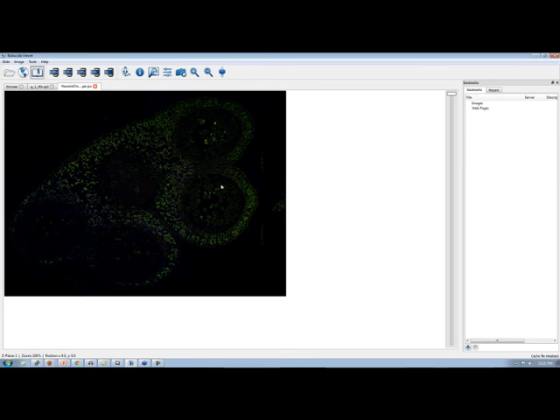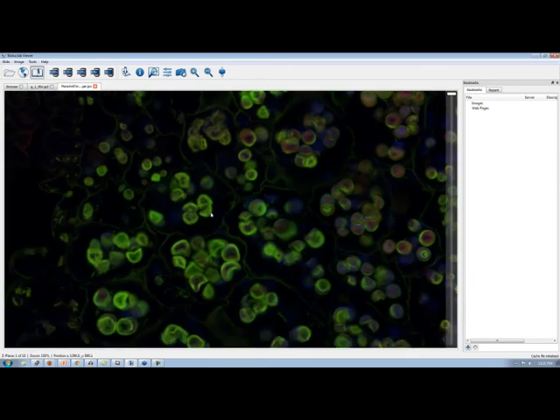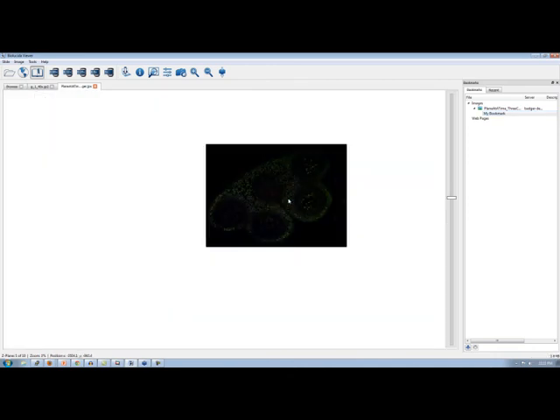What that allows you to do is go to any region that you're interested in, any magnification, any focal plane, and then you can hit this little plus down in the lower corner. That pops up this little bookmark at the top if you see it. You can enter in a name, let's just call it my bookmark. Not very original.